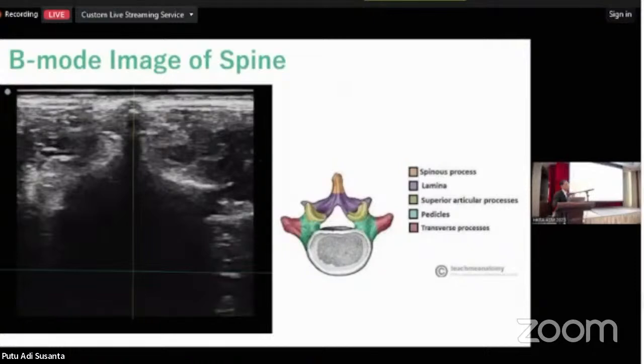This is a B-mode image of the spine, the cross-sectional view. Typically we can see the spinous process on the top and, on the two sides, some lateral features. In the thoracic region, it is the transverse process. Now the main feature in this image, actually from our radiographer's point of view, is nothing, because it's a black region after the bone. So that is also true. So how do we ultimately build this device?